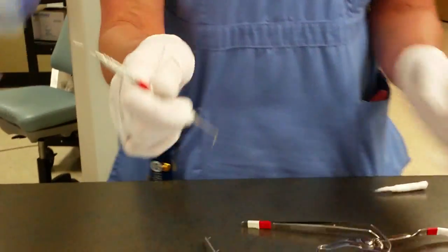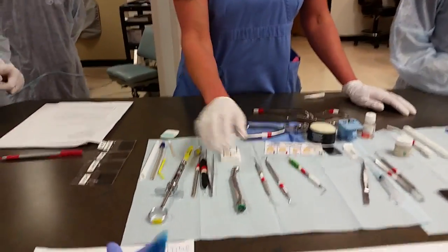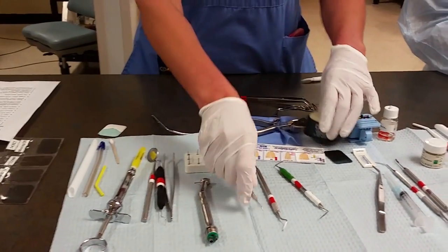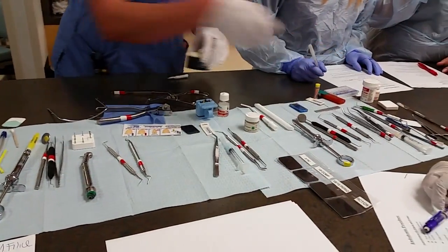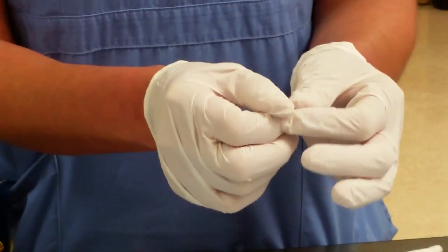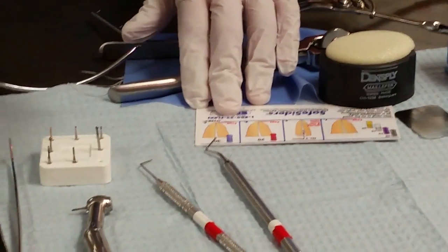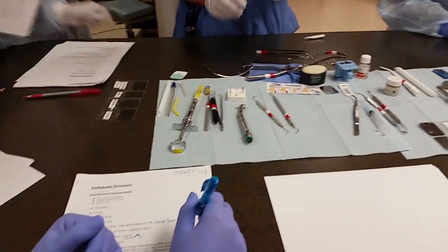So what we've done is we've opened up the canals, we've removed any decay, and we've located the canals. After we locate the canals, we're going to remove the nerve with the barbed broach. The barbed broach is kind of like a barbed wire fence. It goes into the canal of the tooth and removes the nerve — that's what we use to remove the pulp.